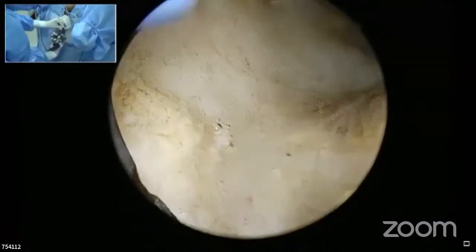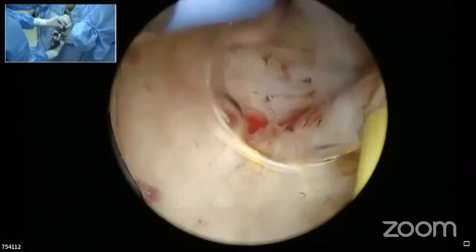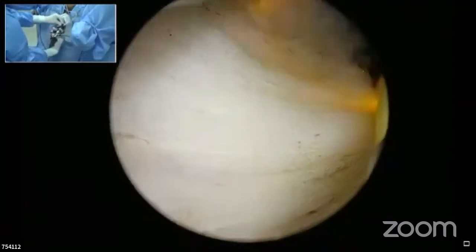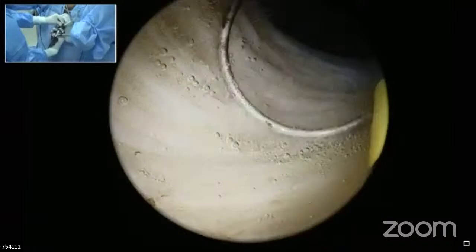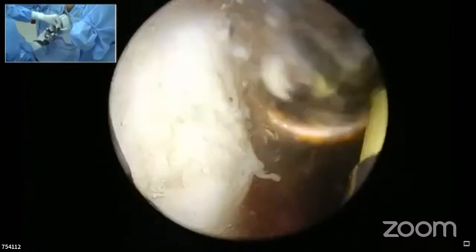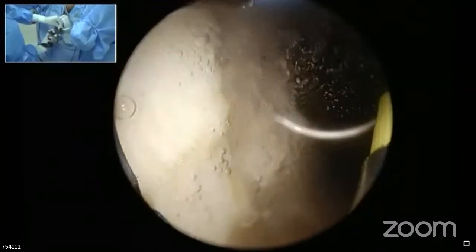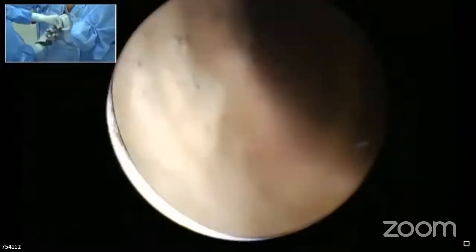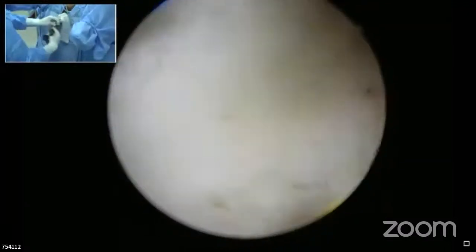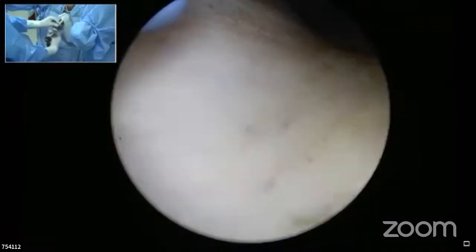So I have to some extent separated and reached the capsule from 12 to 9 o'clock. So as much as possible as the gland moves medially and gives us a space to widen this groove, we can proceed. Now we have devascularized the gland from the feeder at 7 o'clock and the feeder at the 11 o'clock. So this is basically predominantly a devascularized adenoma which has fallen medially.